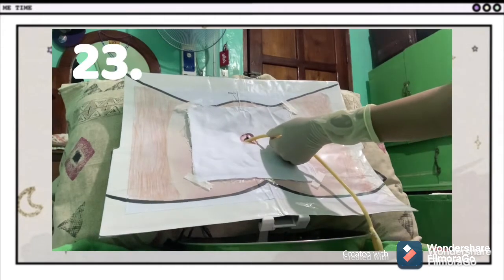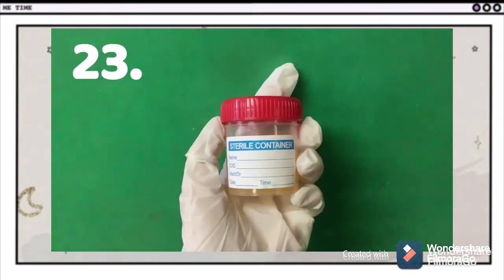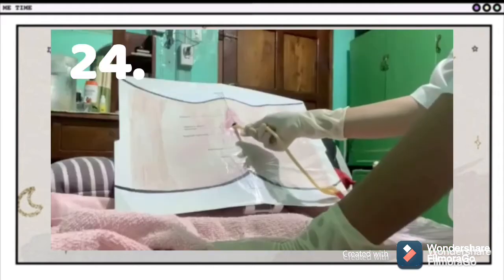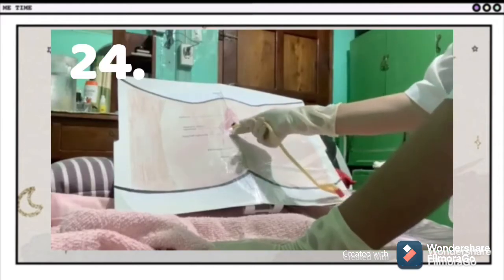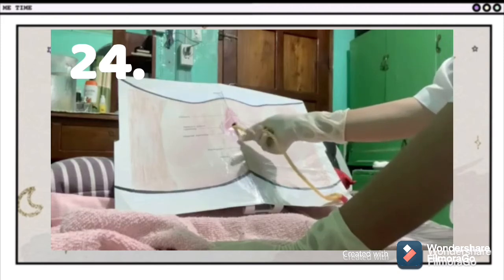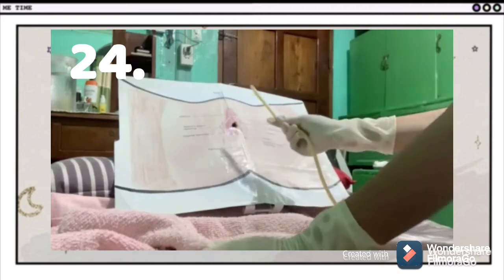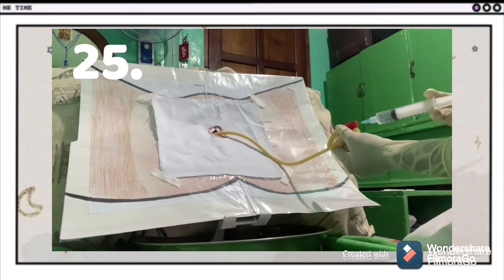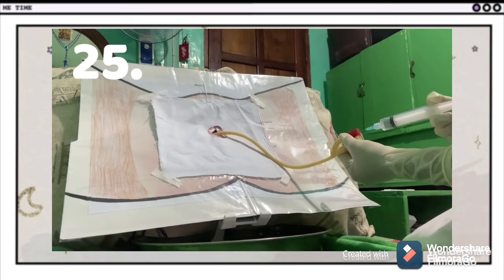Hold the catheter securely with your non-dominant hand while the bladder empties. Collect a specimen if required. Continue drainage according to hospital policy. Remove the catheter smoothly and slowly if straight catheter is used. The catheter is only needed to drain urine present in the bladder and is not intended for continuous use. If a Foley catheter is used, introduce 5 cc of distilled water to secure the catheter. Gently pull the catheter until the retention balloon is snuggled against the bladder neck.